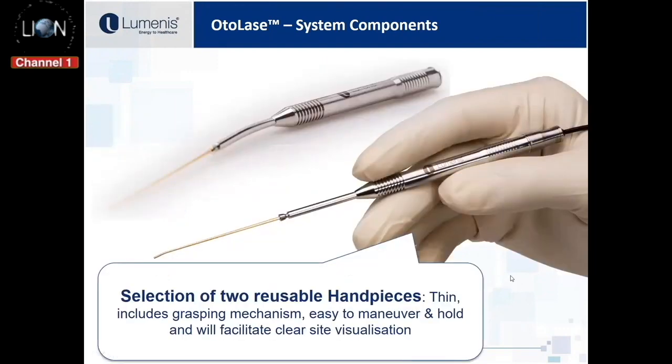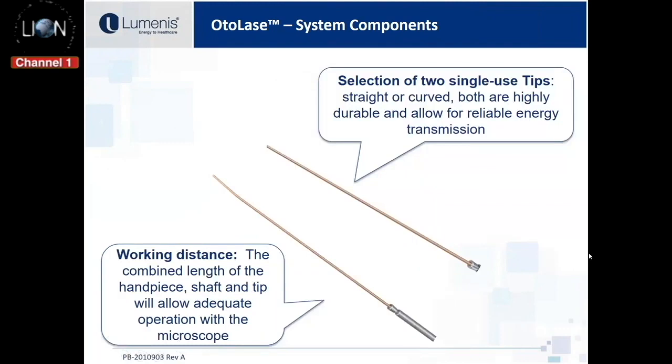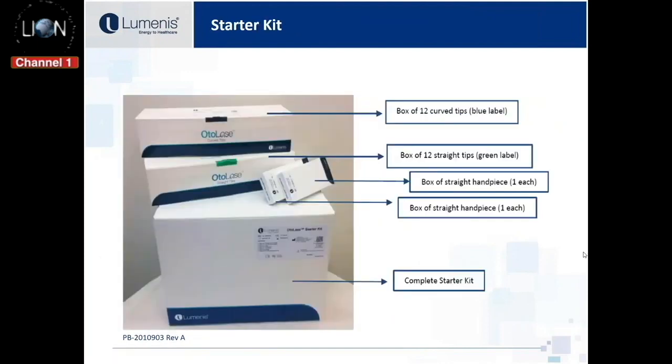Let's focus a little on the depth of penetration. The CO2 laser has the smallest zone of thermal spread in comparison with all other energy-based devices. In theory, the depth of tissue penetration for the CO2 is only 0.1 millimeters. But for a surgeon, that means unprecedented precision and the ability to operate near really critical structures and delicate anatomy, such as those in otology cases.